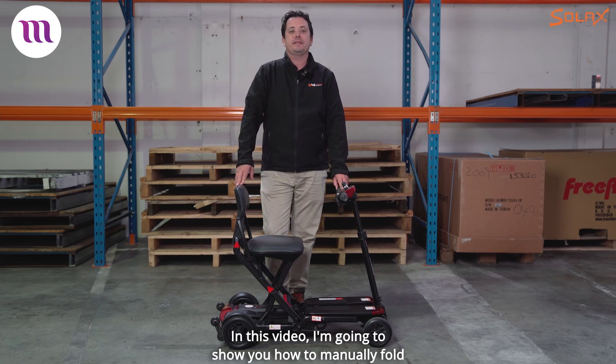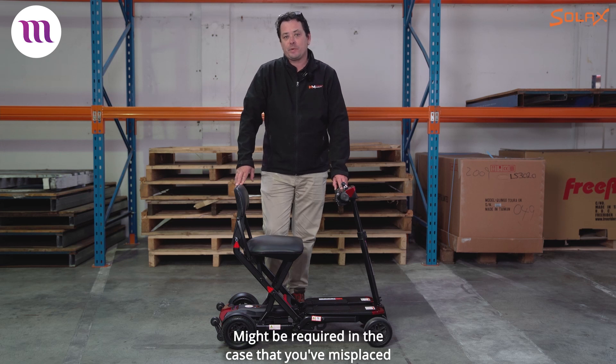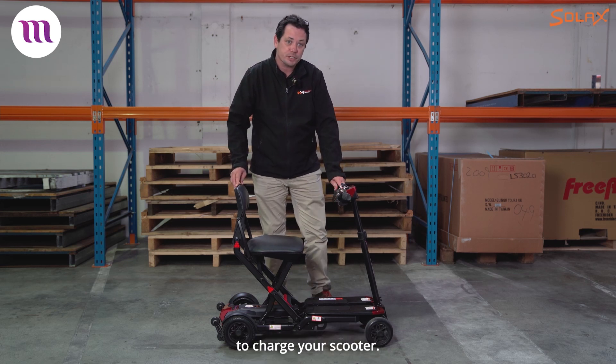In this video I'm going to show you how to manually fold and unfold your Solax Melita mobility scooter. It might be required in the case that you've misplaced your remote control or maybe you've forgotten to charge your scooter.